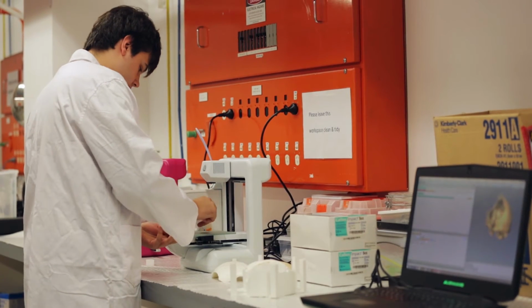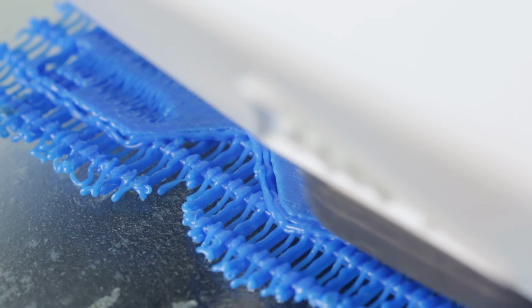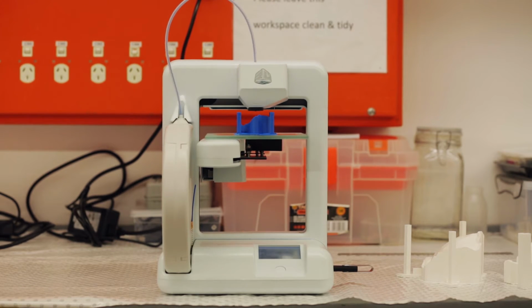The process as a whole is much faster, given that the rapid nature of 3D printing means that there's no machine setup, there's no need to send it to an external source. The machine prints the final template, which is then given to the surgeon for use. In addition, the overall cost of the procedure is lower than conventional titanium implants, given the relatively low running costs and material costs of the 3D printer.